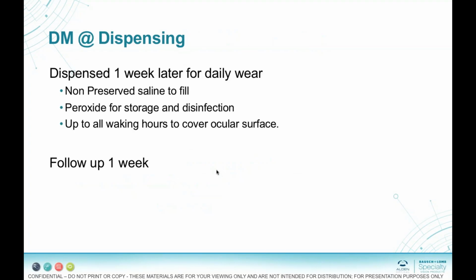She did return a week later for her follow-up and dispensing. The lenses were dispensed. We went through the care and handling process. We instructed her on non-preserved unit dose saline to fill, hydrogen peroxide for storage and disinfection when the lenses were out, or when the lens was out.